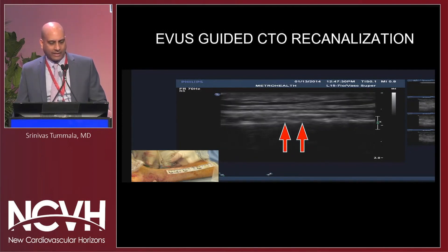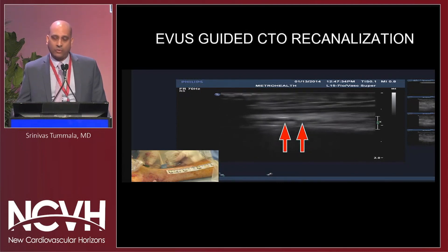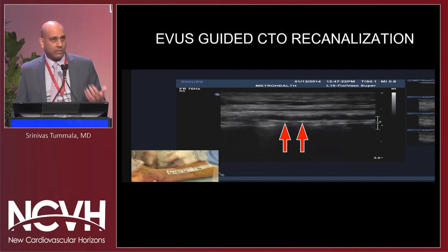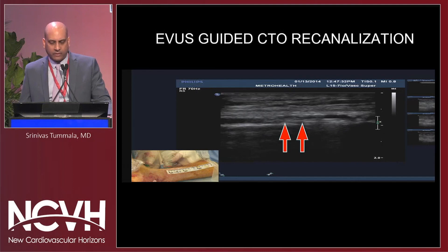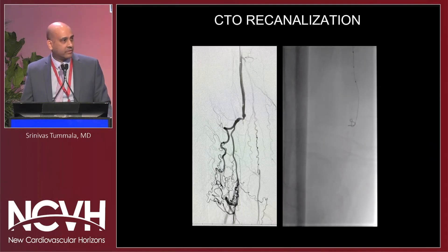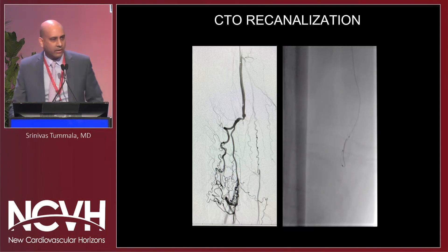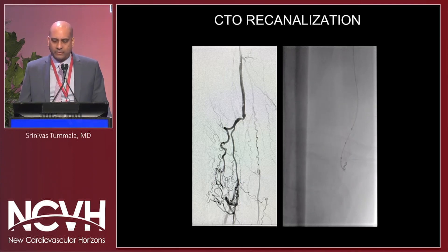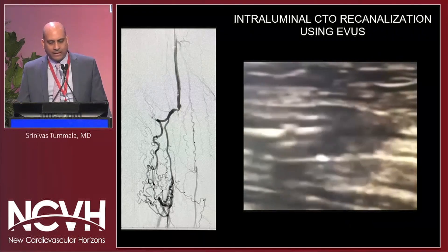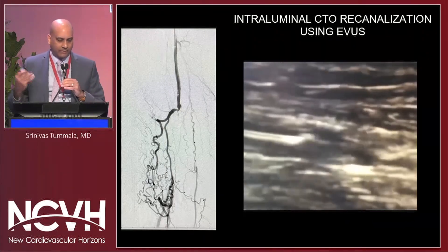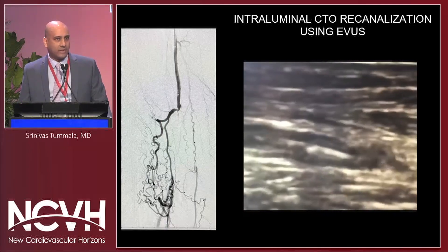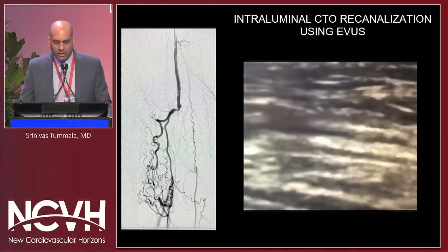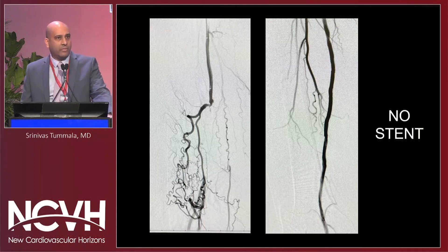Look at how well you can see a guide wire within an occluded vessel being recanalized in intraluminal fashion. Imagine trying to do this with fluoroscopy like we all do — maybe this is an adjunct to help you in cases where you're having difficulty getting through-and-through access. Here's a classic sub-intimal recanalization. You can see the catheter and guide wire spiraling around the artery. Now we have to think about whether we need retrograde access, dual access, or a reentry device. Look at this recanalization using extravascular ultrasound. I have my tech — whom I've trained — helping during cases so that while I'm doing a recanalization, I can see if I'm intraluminal, sub-intimal, or perforating through a CTO. I was intraluminal, so I was able to deliver therapy without having to stent the SFA or popliteal artery, which we all like to avoid.